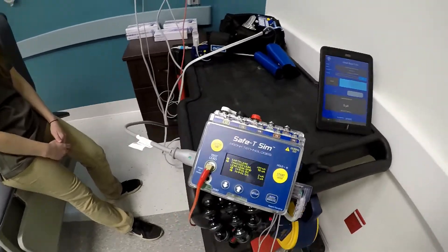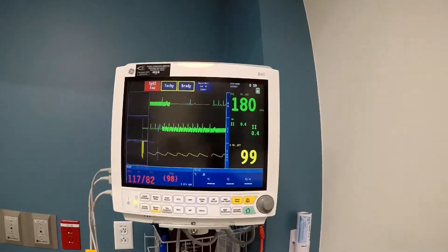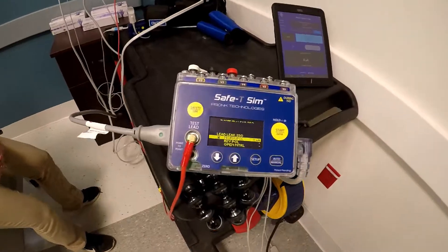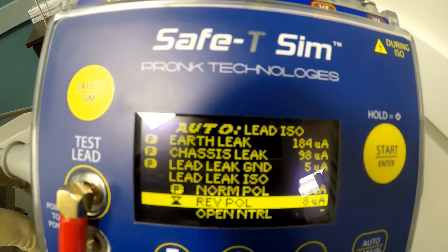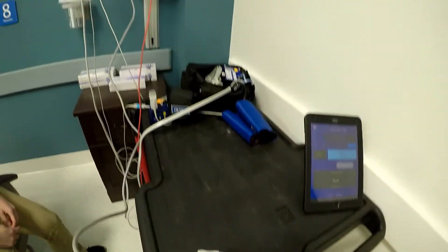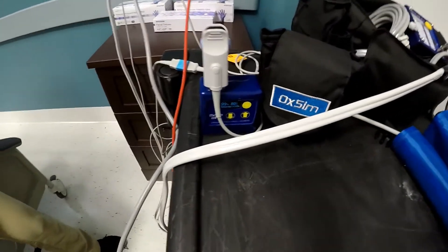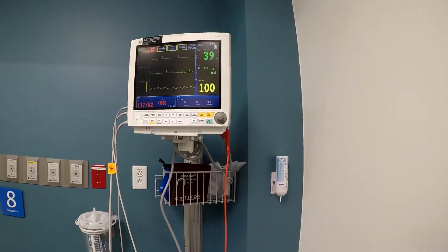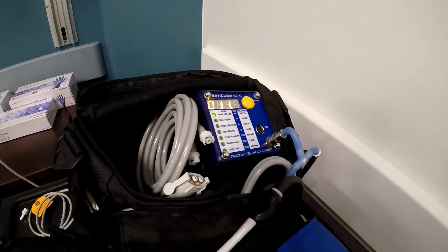It also simultaneously sends a simulation to the unit while doing the lead isolation test. We also utilize the SimCube 5 for NIBP and the OxSim for pulse oximetry, so we're able to run multiple tests at once.